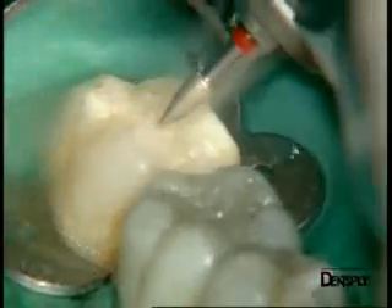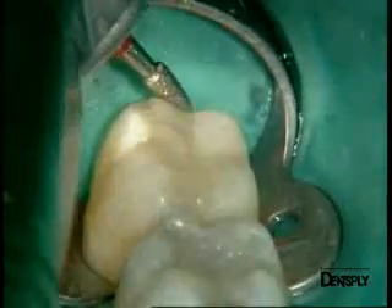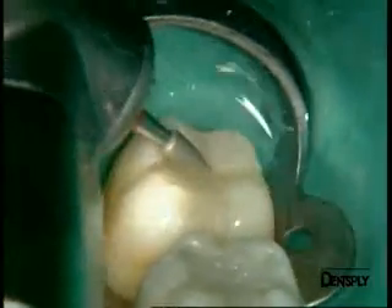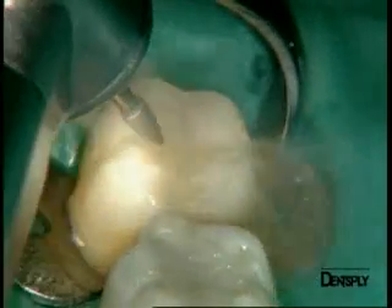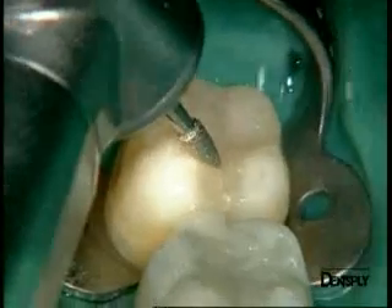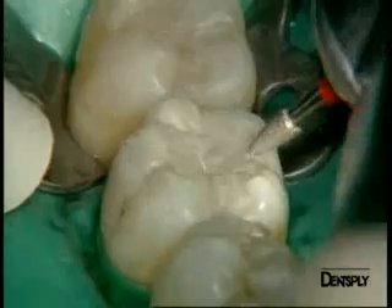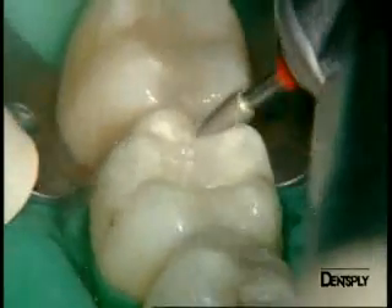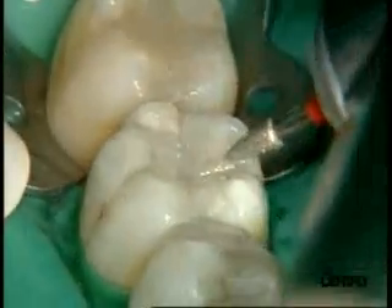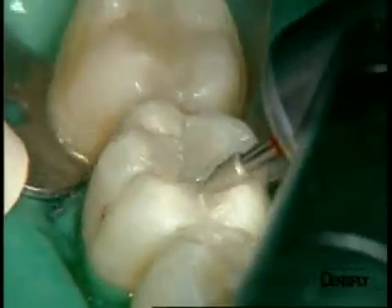We now enter the finishing stages. We use red ring finishing burrs mounted on a red ring contra-angle handpiece rather than on a turbine, so we can better control the pressure on the instrument. We will use them to pre-shape and finish the cusps both lingually and vestibularly. It is also possible with this type of instrument to accentuate fissures, eliminate excess material, and create a good transition between convexities and concavities on the occlusal surface. We always work at a moderate speed to control the movement, since only very small quantities are being removed.